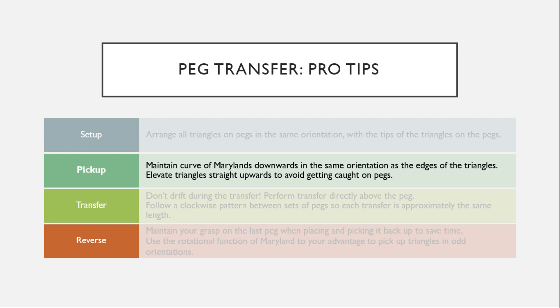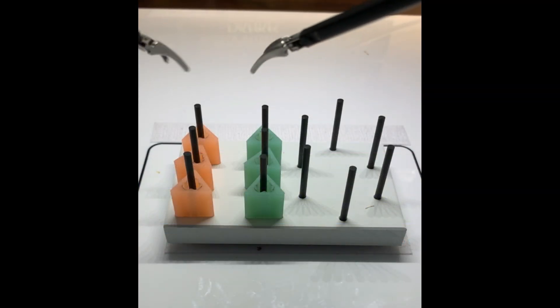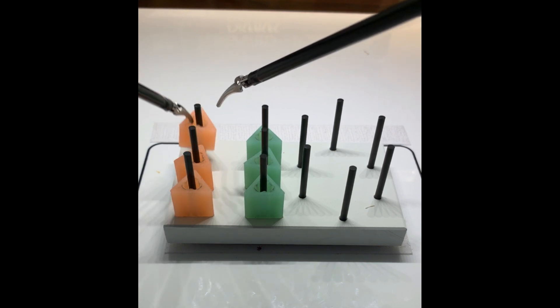The curve of the Maryland's is now downwards in the same orientation as the edges of the triangles. In this next demonstration, you will notice that you want to elevate the triangles straight upwards rather than towards you to avoid getting caught on the PEG.